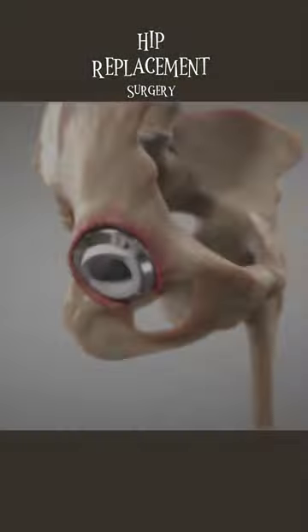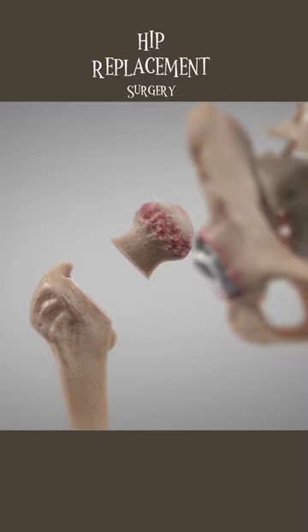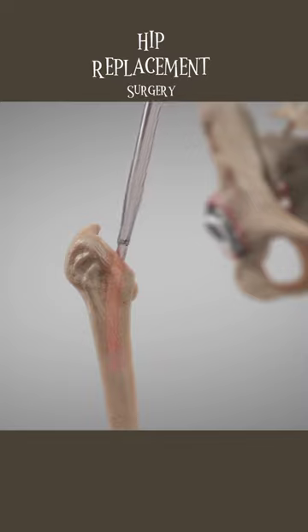The other half of total hip surgery involves the upper leg bone known as the femur. The head of the femur is removed or reshaped during surgery, and the center of the bone is shaped to receive the new implant.